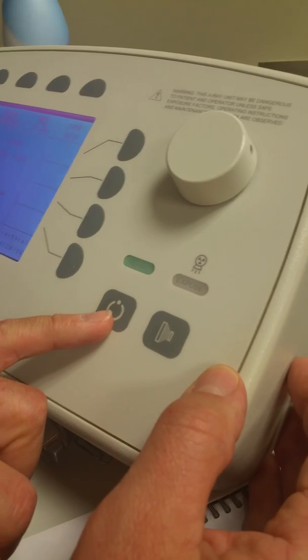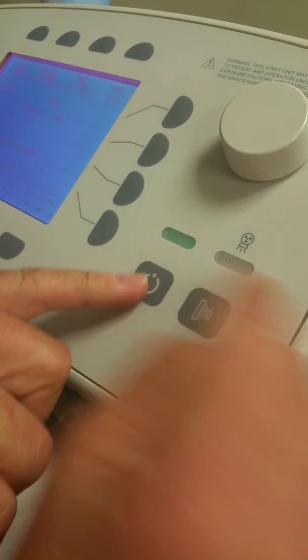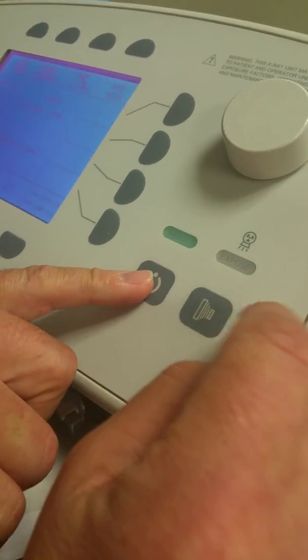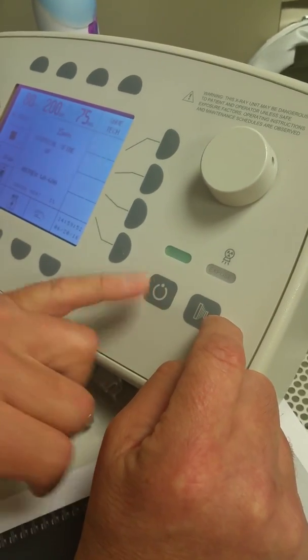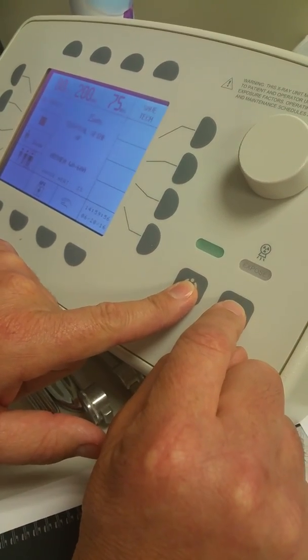The button on the left is your warm-up button. So you're going to press that. You'll see it light up. Once it lights up in green, that means you're ready to take the x-ray, and while you're still holding the button on the left, you push down the actual exposure buttons.